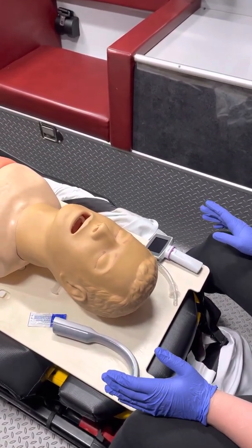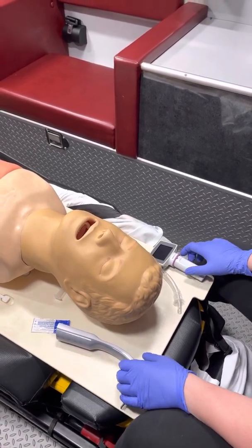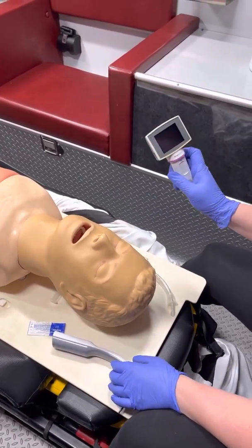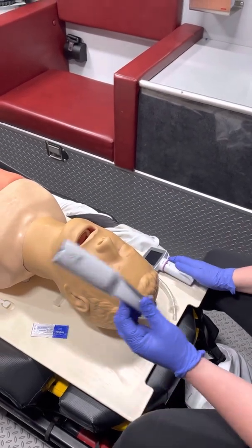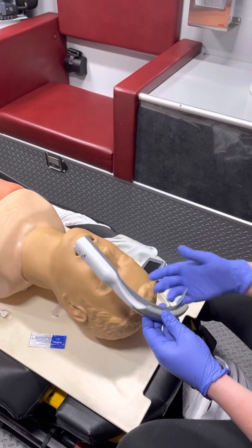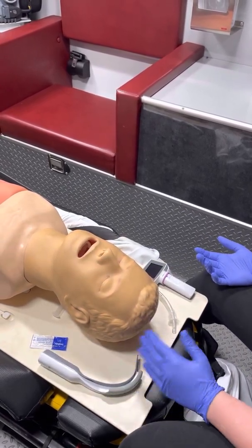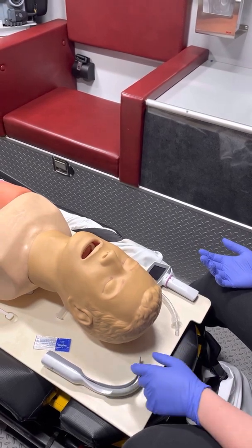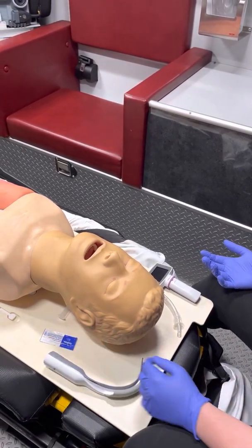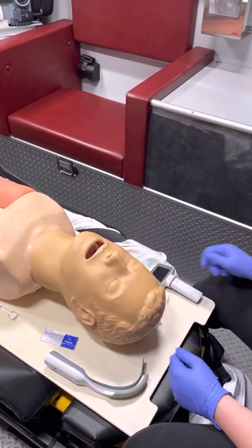In this video we're going to demonstrate the King Vision laryngoscope. The tools you need are your King Vision camera unit, your King Vision blade — I use the blades that have the track already in them so I don't have to use a stylet. They do make blades without the track but I find them harder to use, so I prefer the blades with the track. You'll also need your lubricant and your ET tube with your 10cc syringe.